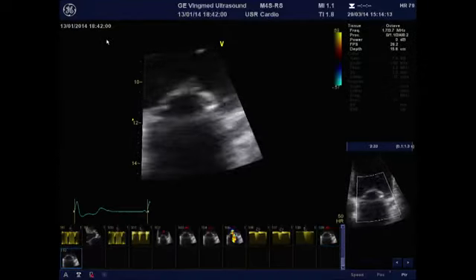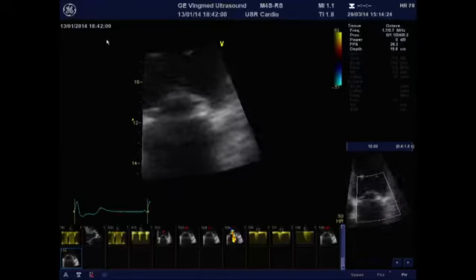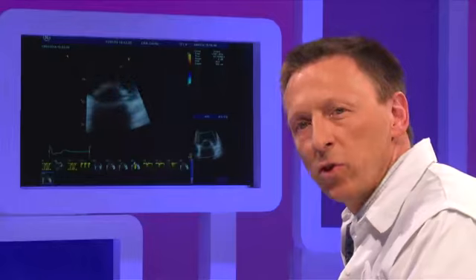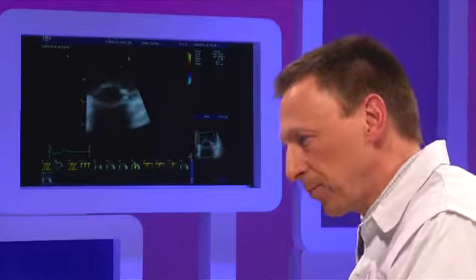functional secondary mitral regurgitation. And it's important to describe and classify the mitral valve, because functional mitral regurgitation is much more likely to regress following aortic valve replacement, in case this patient should undergo surgery. And in this case, because it's functional mitral regurgitation, it's more likely that this will spontaneously decrease after unloading the left ventricle by the isolated aortic valve replacement.